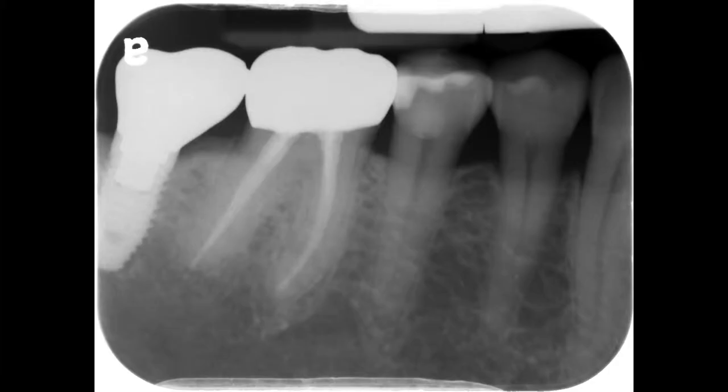You are now ready to capture the image. A good mandibular premolar periapical radiograph will present the distal half of the mandibular canine, all mandibular premolars, and 2 mm of bone apical to the apex of the root.